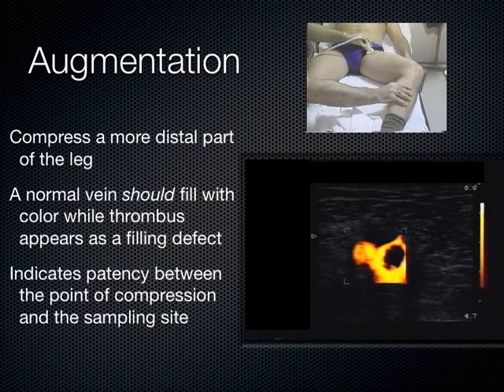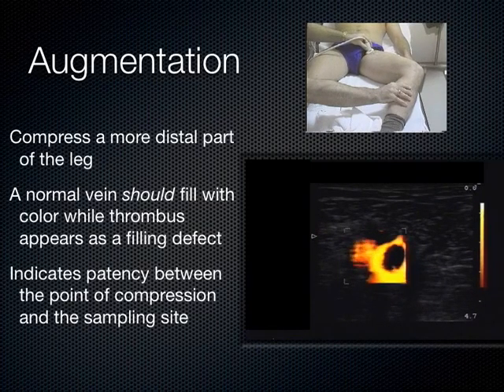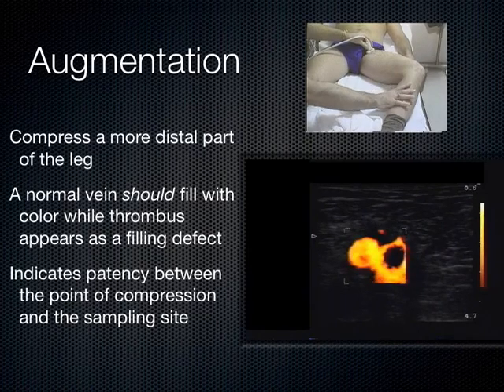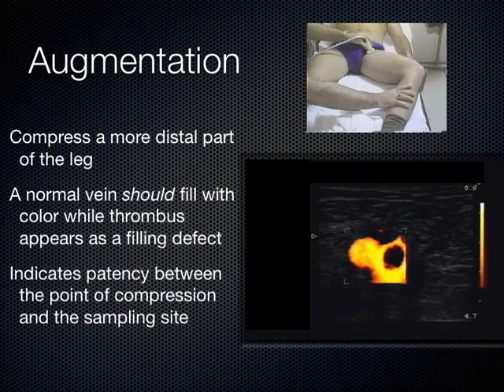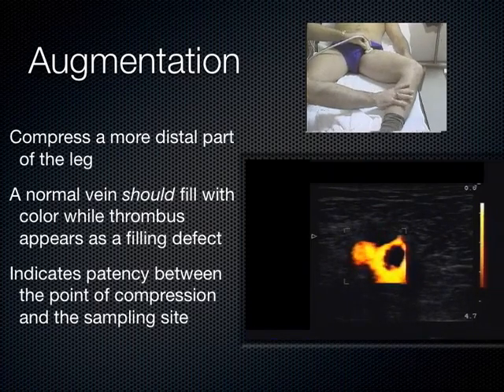It's a fun thing to do. I do it all the time. It's sort of a geeky ultrasound thing I love to do, but I can't rely on it. It's really only the grayscale compression alone, the 2D ultrasound image, no color involved, that rules in or out the DVT. There are lots of other color techniques that don't stand up under clinical conditions, so you can't really use them. Even though today we'll probably be doing it because it's fun to see the anatomy link up that way. I think that's cool to show you, but diagnostically it's not useful.